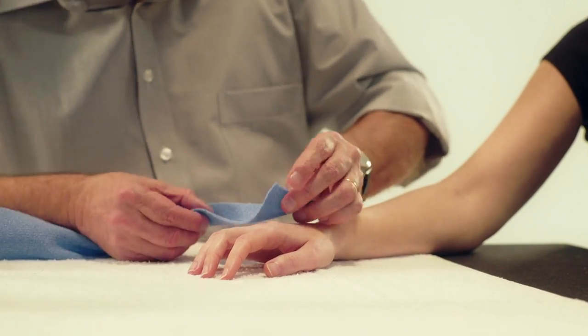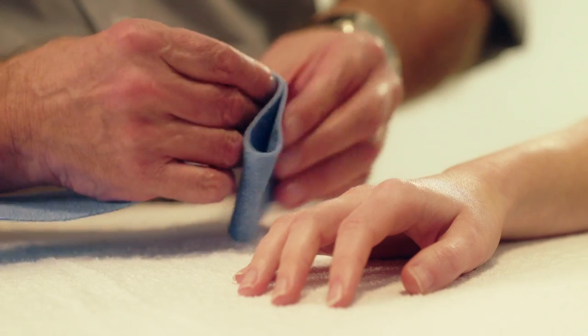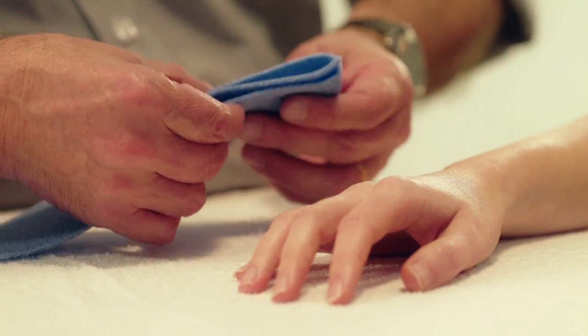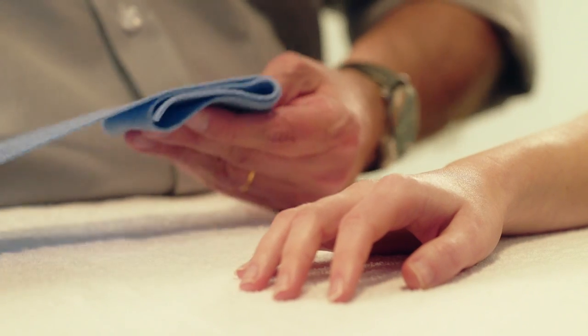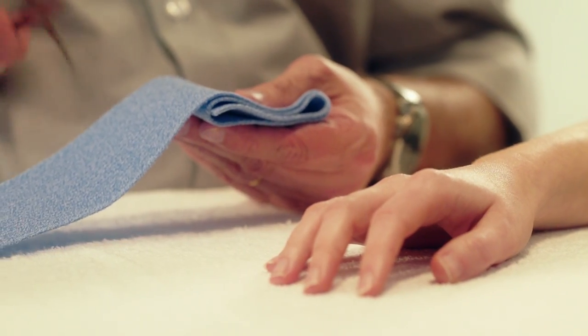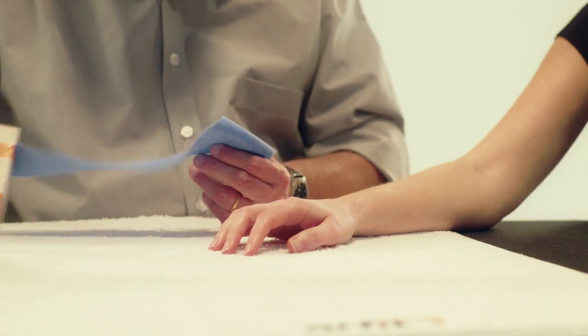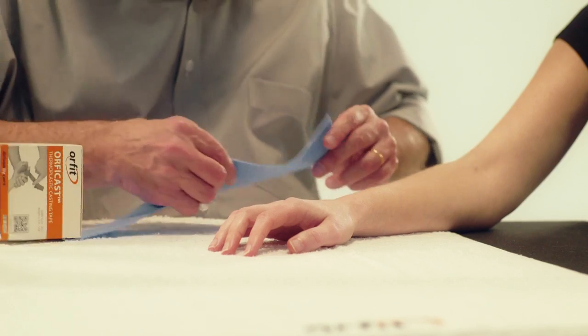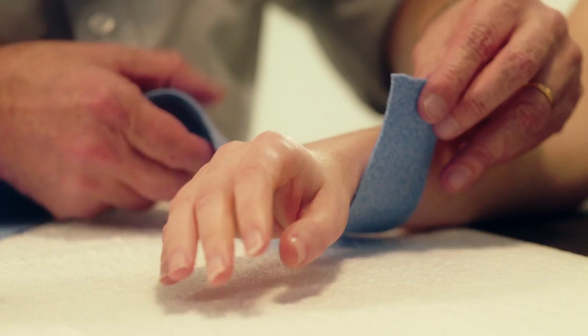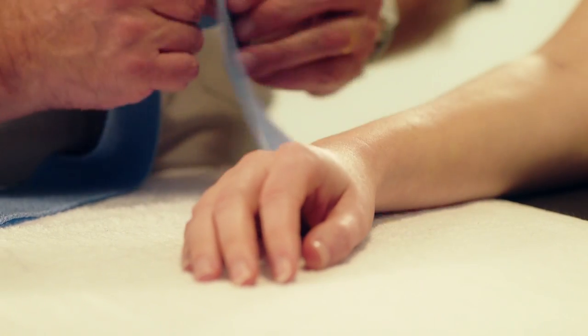We will need two different pieces of Orphicast. Take the first strip of Orphicast six centimeters wide, measure four times the width of the hands at the level of the MCP joints and cut it accordingly. Take a second strip of Orphicast six centimeters wide, measure two times the circumference of the wrist and cut it accordingly as well.